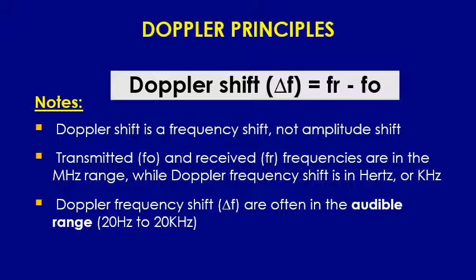So it is found by chance that the Doppler shift from moving blood, usually in arteries or veins, falls in the audible range. This is why sometimes when you activate the Doppler waveform, you will hear the sound. Where is the sound coming from? Because the Doppler shift is in the audible range, we can hear it.